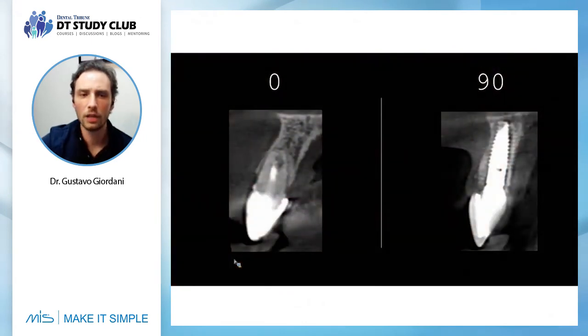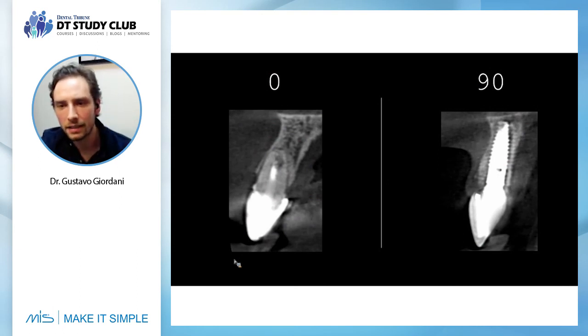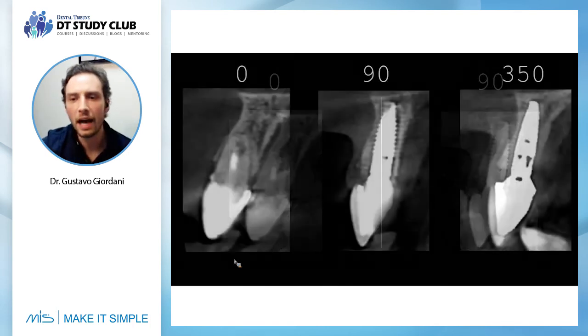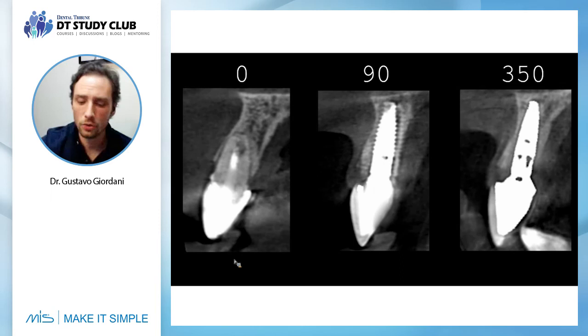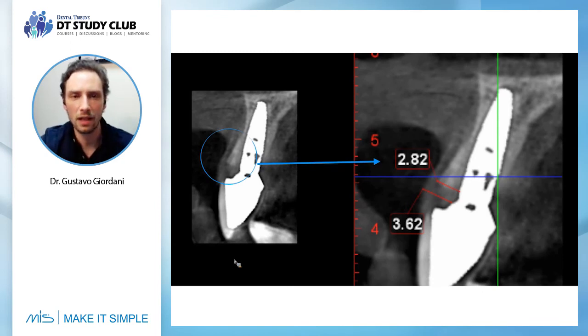is very happy. So now it's the initial CBCT. After placing the implant in 90 days, you see the implant in the correct position by using the guide, the biomaterial, the quality of soft tissue, and after 1 year, this looks very stable. When you use the V3, the bone around the implant is very stable. When you use connective tissue graft, everything looks very stable. And as you can see here in the tomography, we have everything that we discussed.